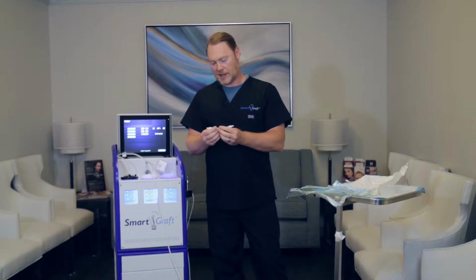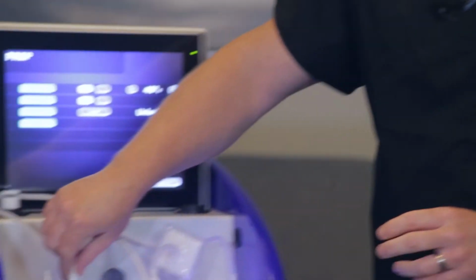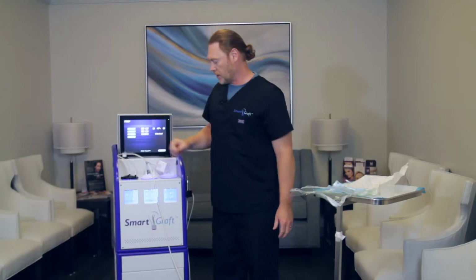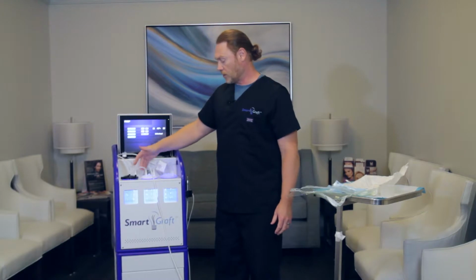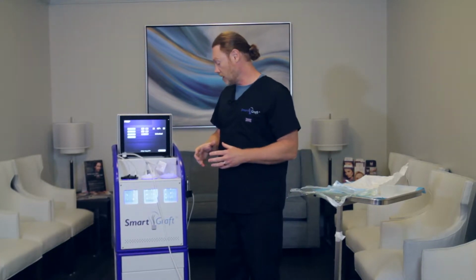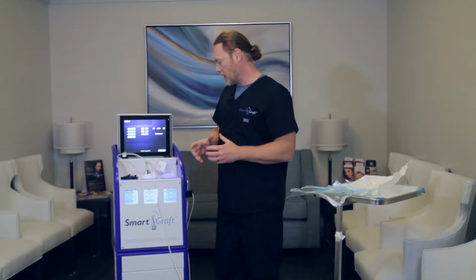The third tube actually has 2 different nozzles on it. They're both the same, and it's going to be basically going from the graft canister over to the overflow canister. So each one has a function here. This one is going to capture the grafts. This one is going to be the overflow, the saline from the misting. And this one here is actually going to contain the saline itself to go over to the graft canisters to keep the grafts wet. So that's the basic graft canister setup.